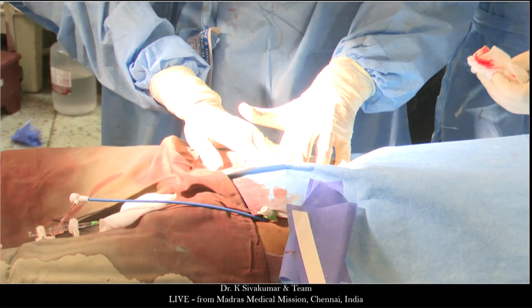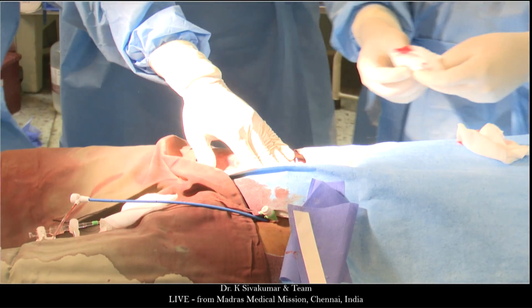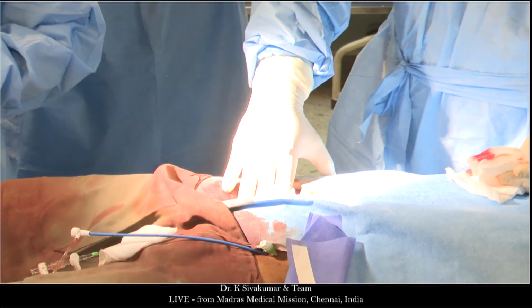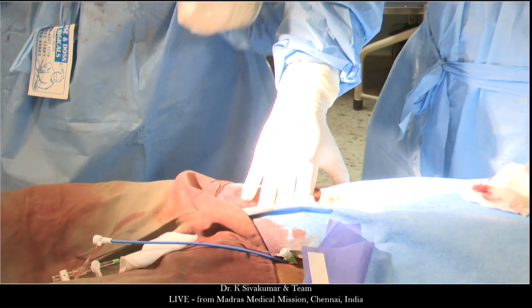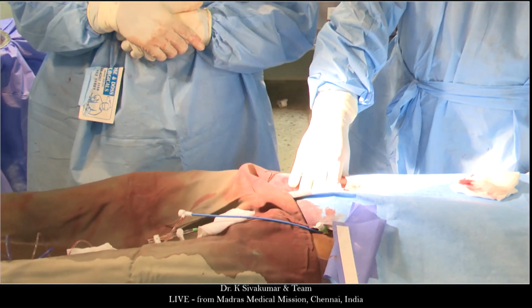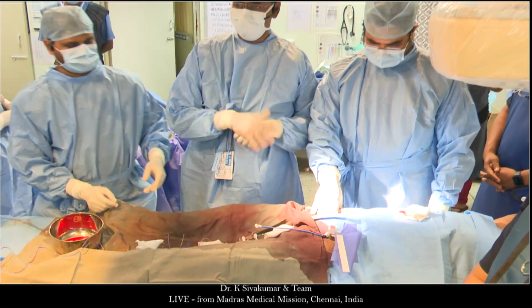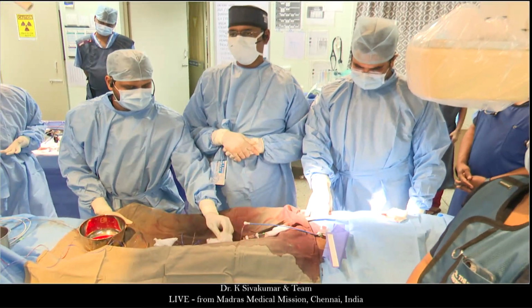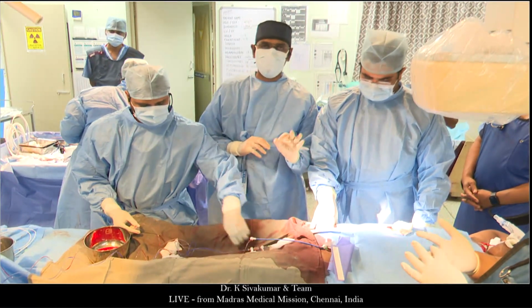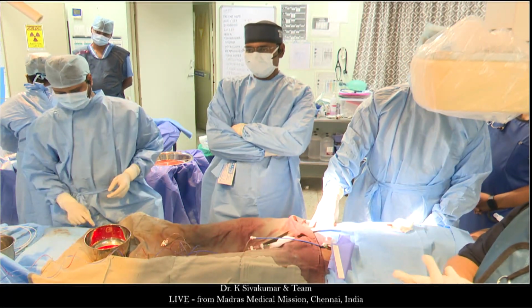So the answer to the question is, if you have a guide wire circuit still present, you will be able to push the lower end of the embolized stent in the right atrium up with a compliant balloon, something like either a Cook Coda balloon or a Medtronic Reliant balloon. There are ways of tackling an embolized stent if it is within the wire, by using an overlapping covered stent. Great. Thank you, Sivakumar.